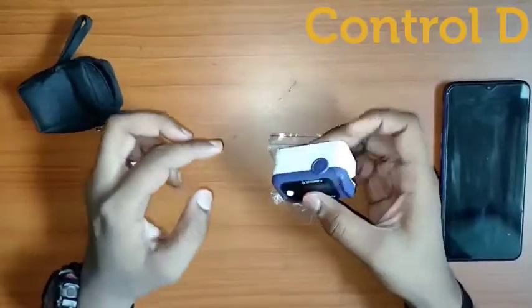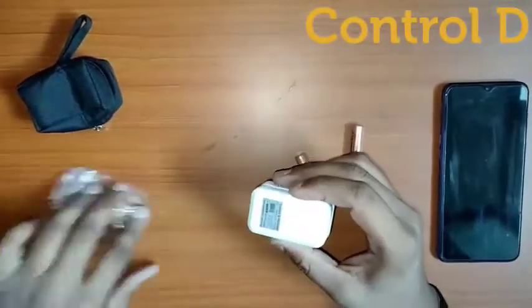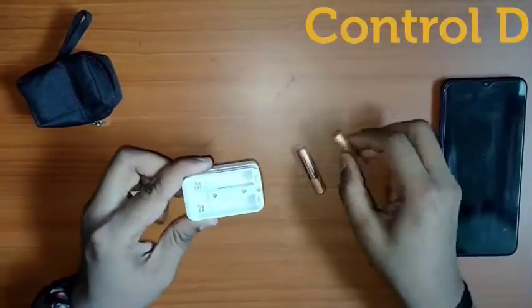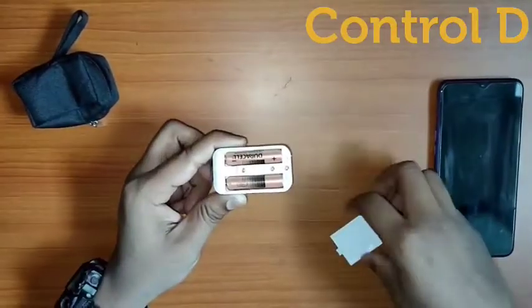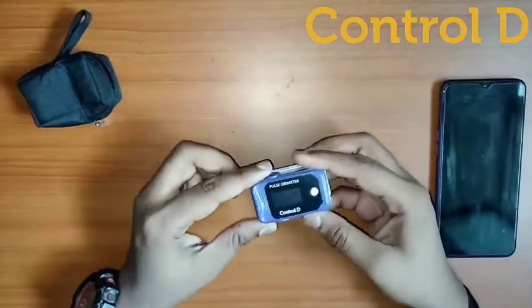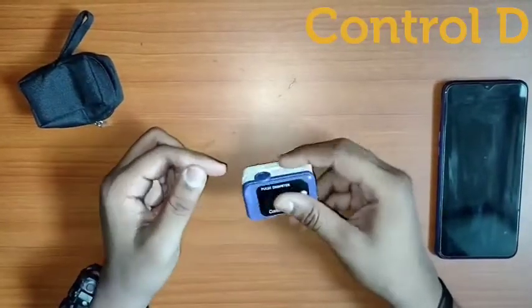You can see the Oximeter is in blue color. Let's take out the batteries from it and insert the batteries in the slots of the Oximeter. After inserting the batteries properly, it's ready to use.